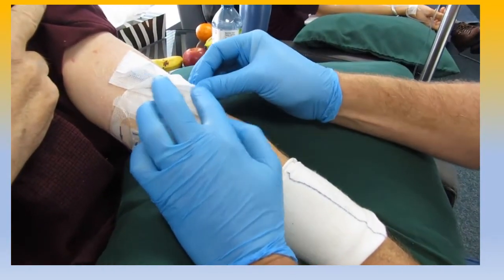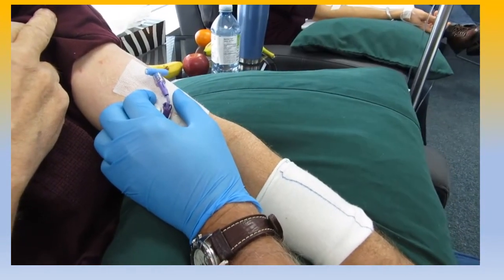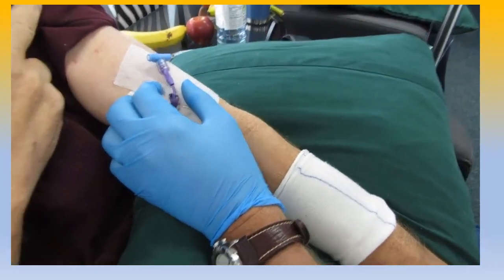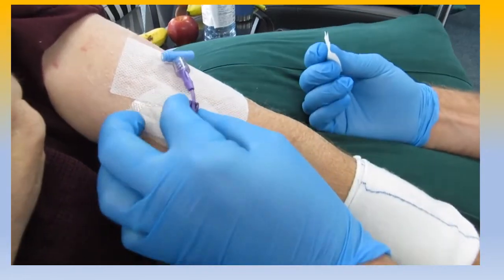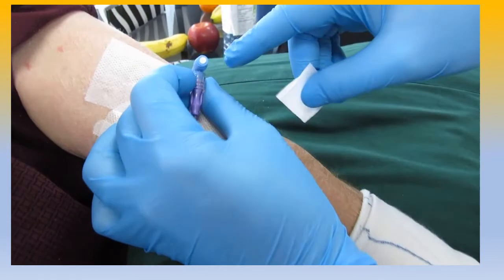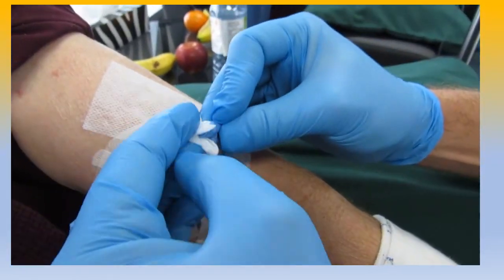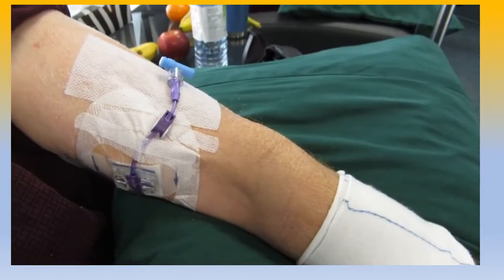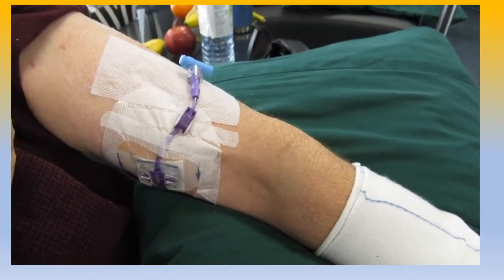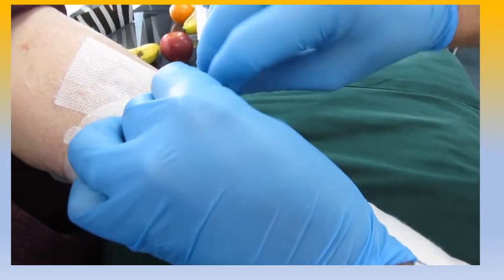So this is a PICC line. Here we have the clamp, and here we have a one-way valve. So we swab the one-way valve just to clean it effectively. He is scrubbing the hub, just like we said. Scrubbing is the thing to do rather than the alcohol. The alcohol doesn't do a whole lot, if anything. So typically do this twice.